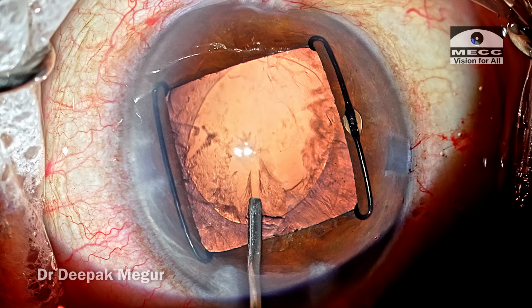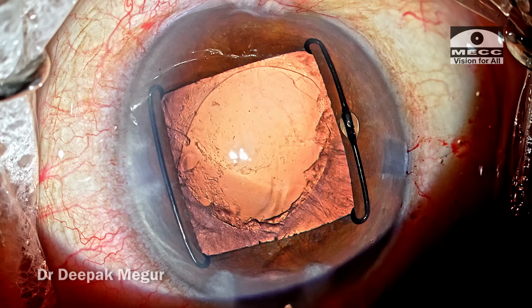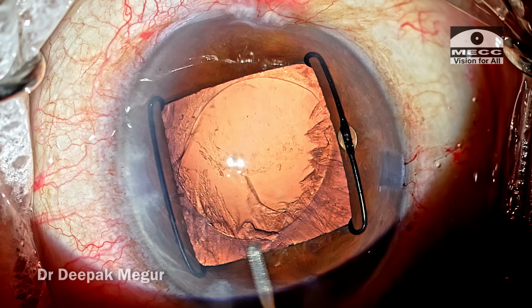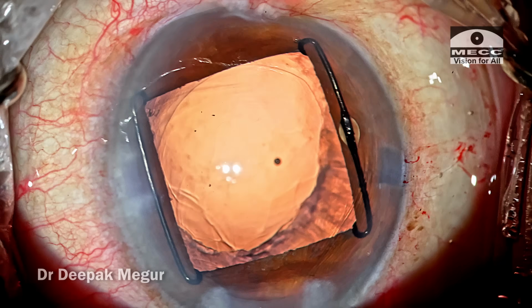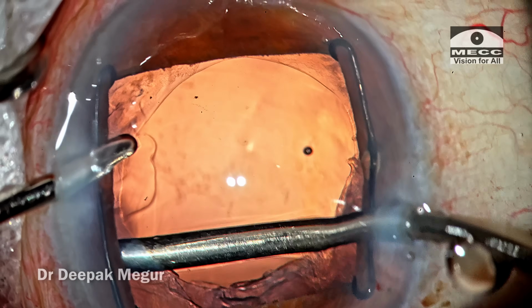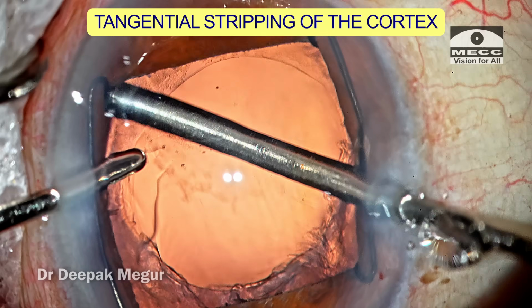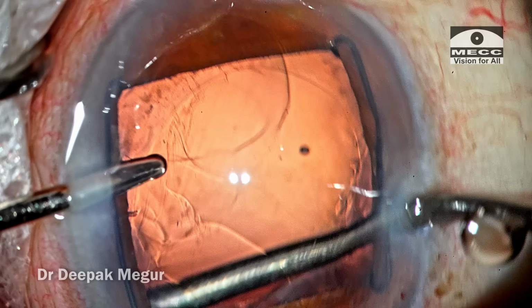One of the reasons is we usually don't get a very efficient cortical cleaving hydrodissection simply because there is no counter traction by the zonules, as a result of which the cortex could be quite sticky to the capsular bag, and there is every risk of damaging the bag or the zonules during cortex aspiration. So I go in with my bimanual aspiration. I'm trying out the tangential way of stripping. This ensures a minimal chance of pulling out the zonules.